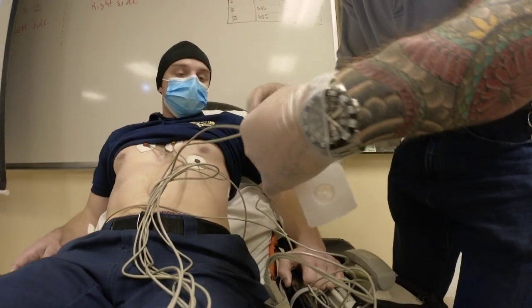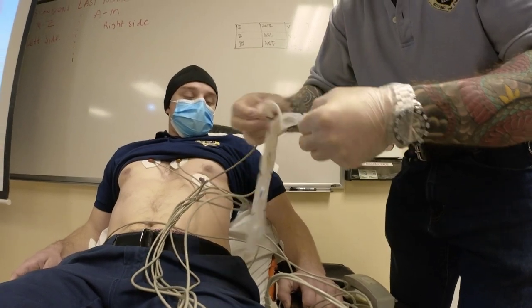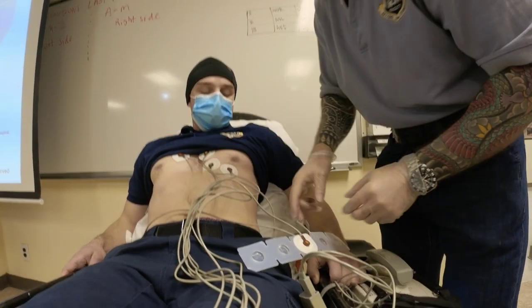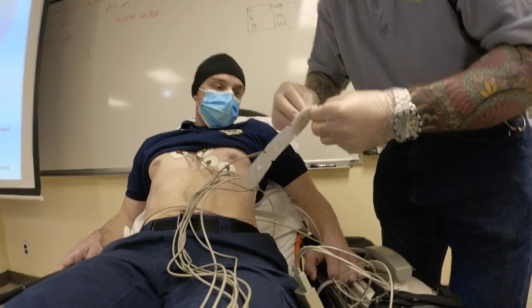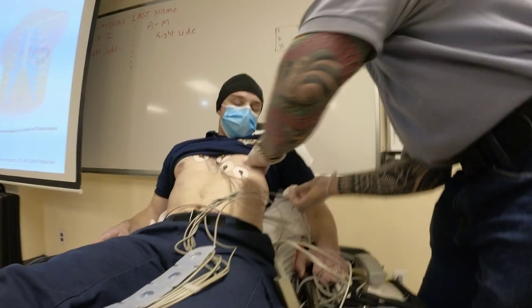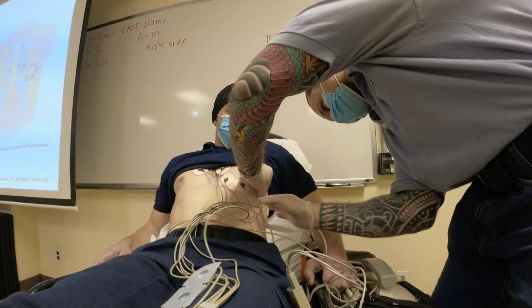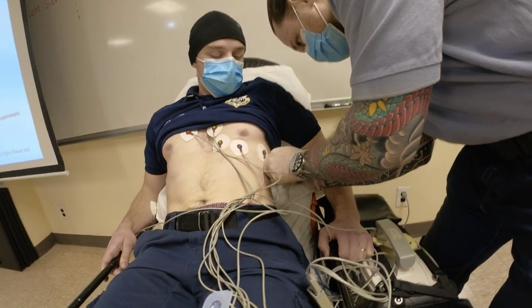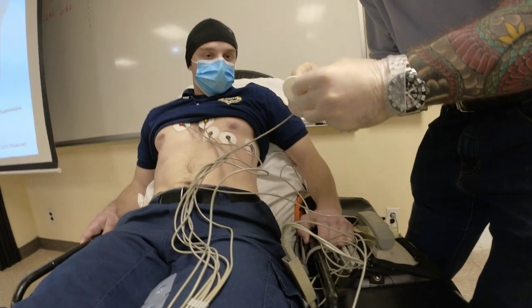Next lead you're going to put is V3. V3 goes in between these two. And the next lead you're going to put is what? V5. My V6 snapped off. So what I would do is I would not place it on him like this.